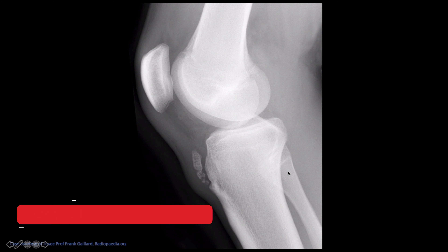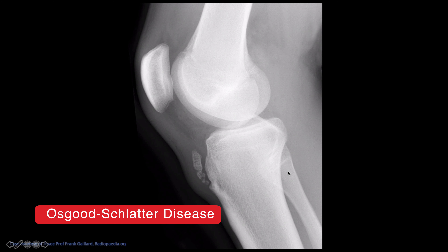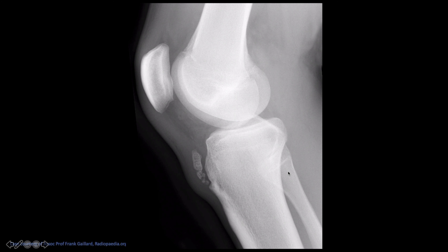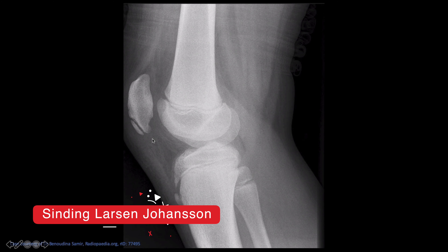Next is Osgood-Schlatter disease, which affects boys between the ages of 5 to 15, especially those who jump and kick. It's a chronic fatigue injury from repeated microtrauma at the patella tendon insertion point, and you see bony fragments at that insertion point. This is a clinical diagnosis - you can sometimes see this in asymptomatic patients, so you can't call this Osgood-Schlatter disease without a distinct history. A similar condition on the contralateral side of the patella tendon is called Sinding-Larsen-Johansson syndrome.